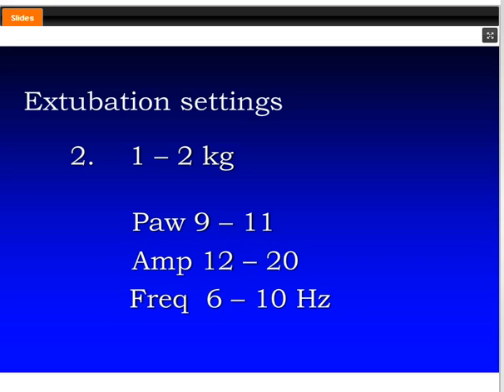Frequency doesn't seem to matter much. And again, for the smaller babies, CPAP would be a better extubation. The bigger could probably go to a high-flow cannula or either of those to a NIPV.